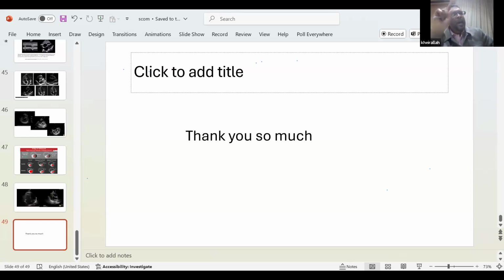Yes, it might be accurate. Accuracy is one measure of clinical uptake. We need an accurate measurement, but we also need reproducibility, meaning I can do it, you can do it, somebody in the UK can do it, all of us equally and similarly with the machines we have. Now 3D is a problem. We fail to do it as accurately as the core labs in Mayo Clinic. So that's the problem of 3D. Therefore we don't routinely use it, and when we try to use it, we can't get the images that we are aiming at.